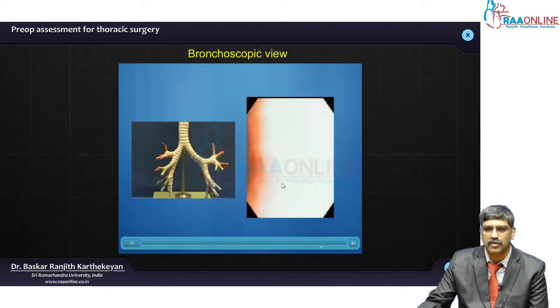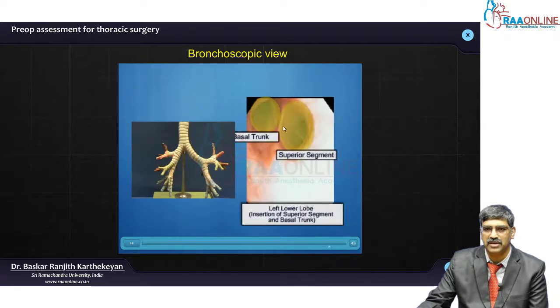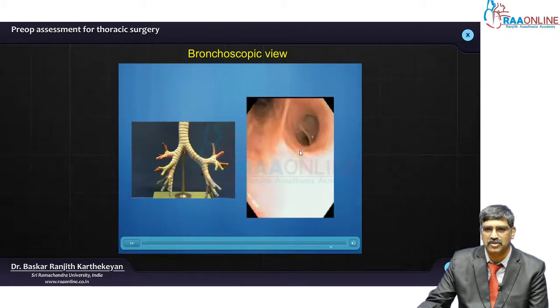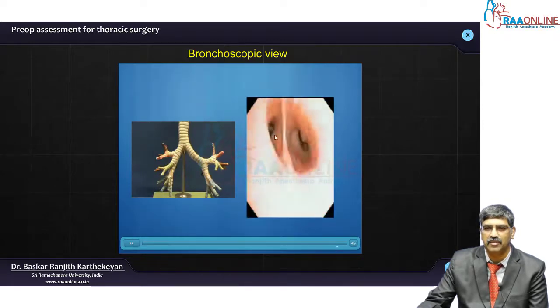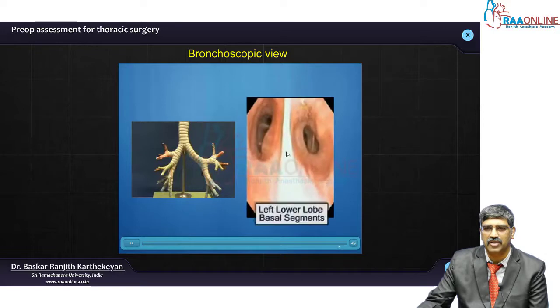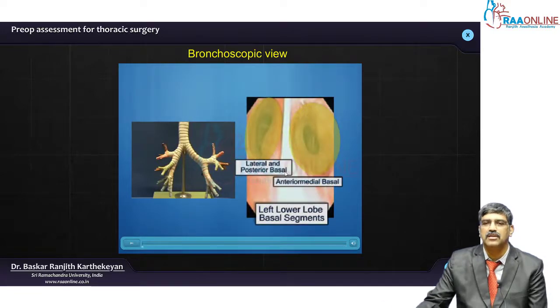As you move into the lower lobe, sometimes you have 4, sometimes you have 5 segments. Here you can see the superior segment and the basal trunk. The basal part is again divided — you can see the superior segment and the basal part divided into anterior medial basal, lateral, and posterior basal.